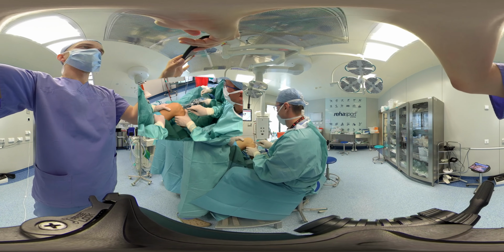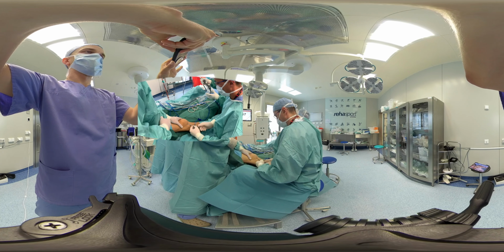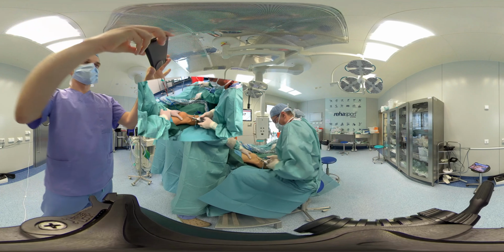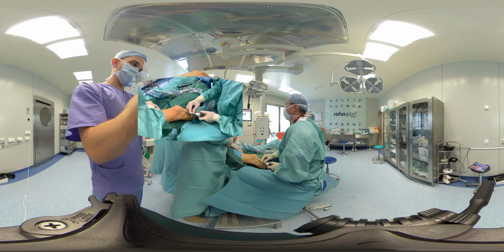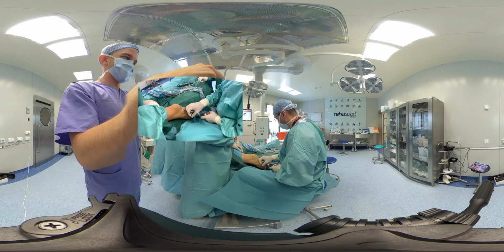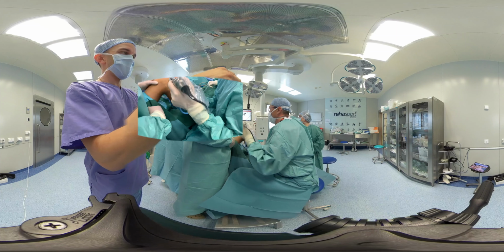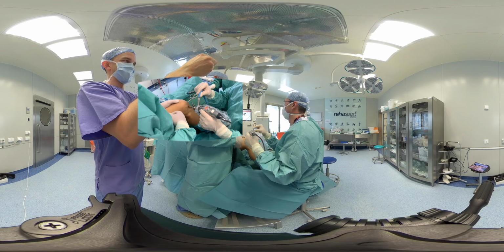The patient is typically in anesthesia. The first step is to place a good portal in the knee joint. Access with the trocar from the lateral side. Camera head in the knee joint. The first part of the procedure is arthroscopic diagnostic. We look at the patellofemoral joint, the medial compartment, the lateral compartment and the anterior part of the knee.